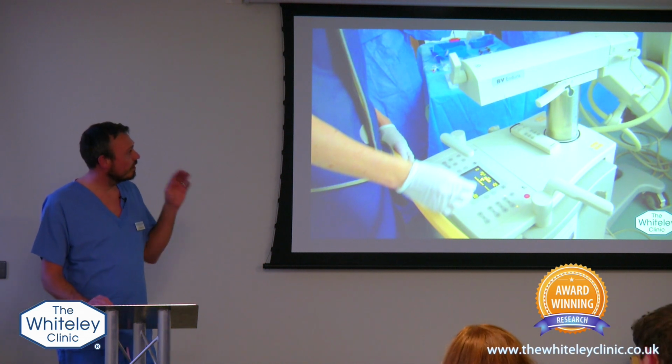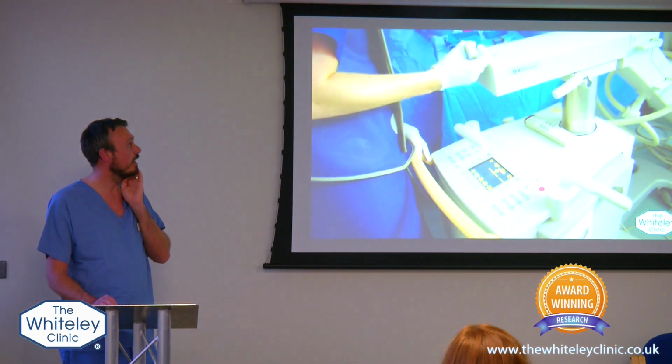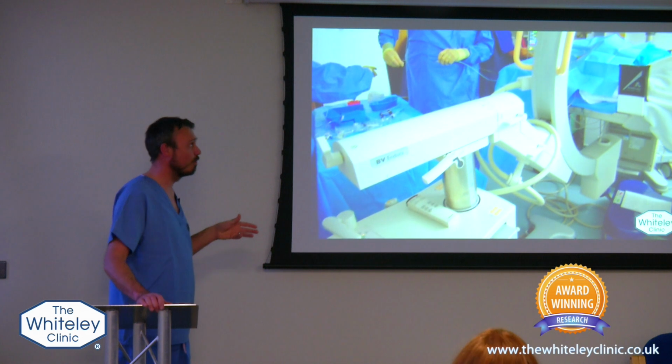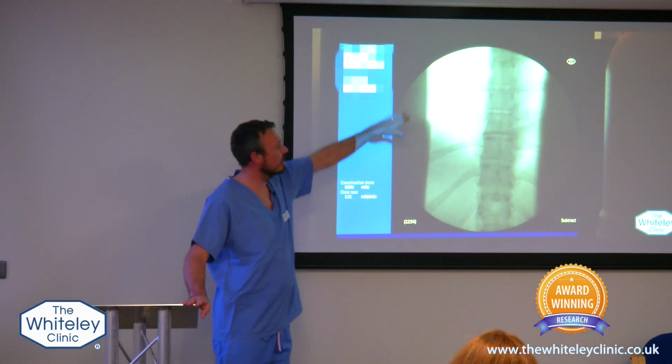This is a short video just of the actual clinic room in London as well. So Matt's just going to play that. What you're seeing essentially, and I'll just talk over the video somewhat, is this machine here, which is what we call our C-arm. That's what shines the X-rays. This is looking at the X-ray itself.